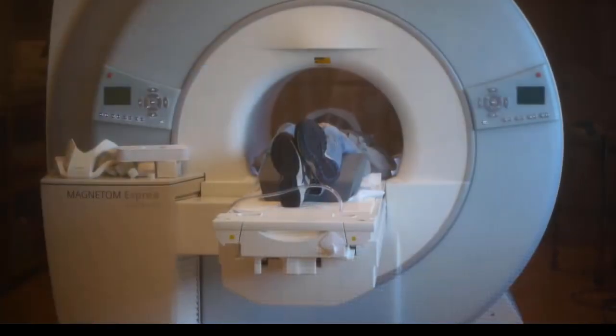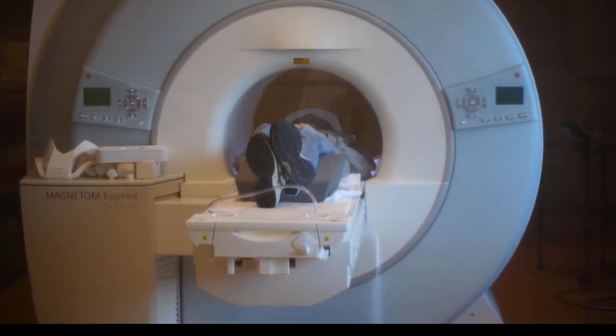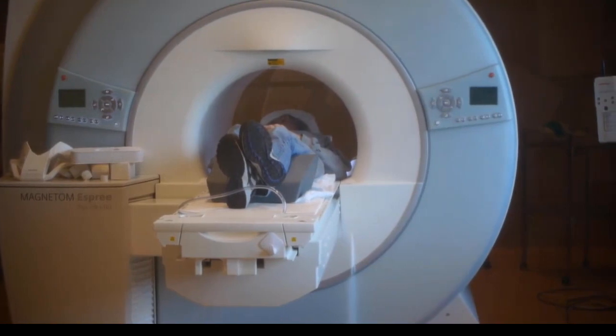But when patients get into our room, they see that the window is quite bright, there's a lot of light in the room, and that the bore itself is a lot larger and shorter. So patients who are getting a knee MRI, for example, their knee is in the center of the scanner, but their head is outside the scanner. Their chest is outside the scanner, so they don't feel claustrophobic.